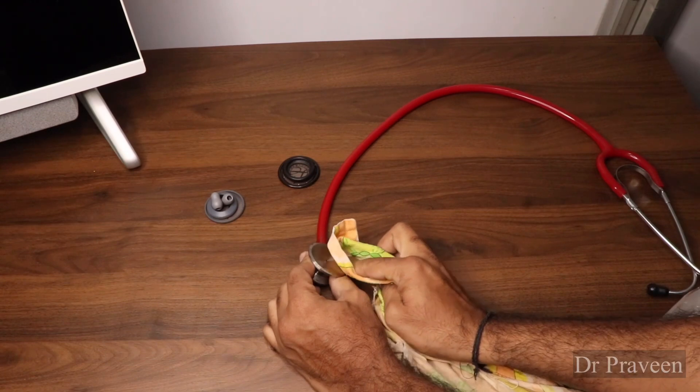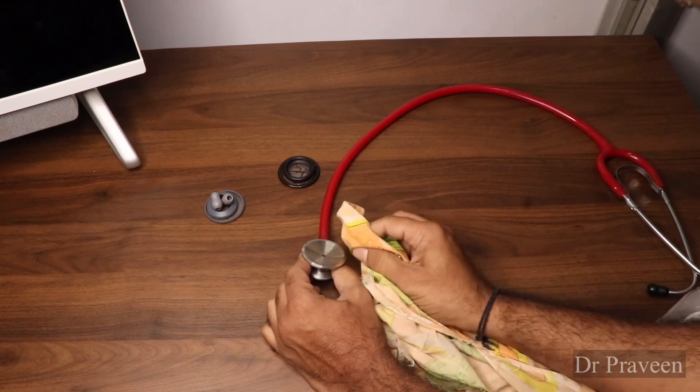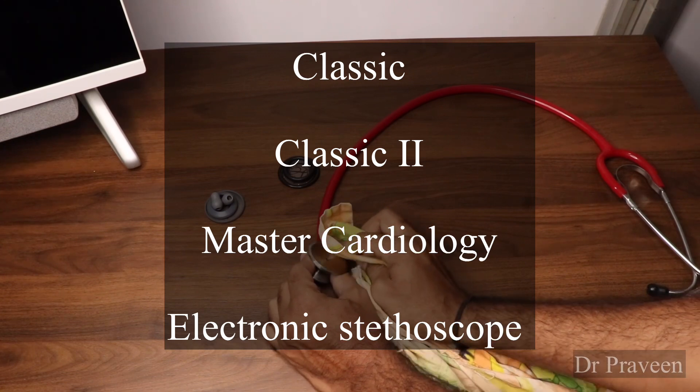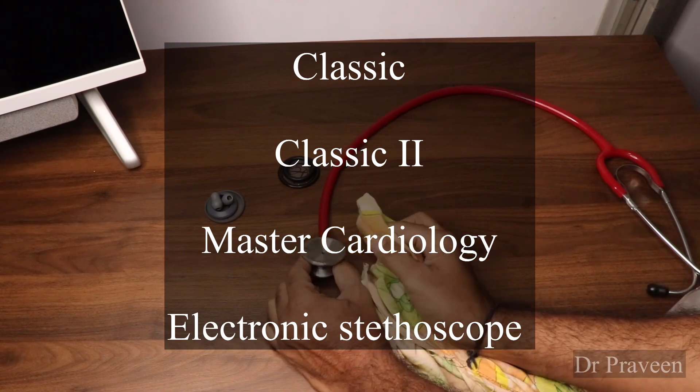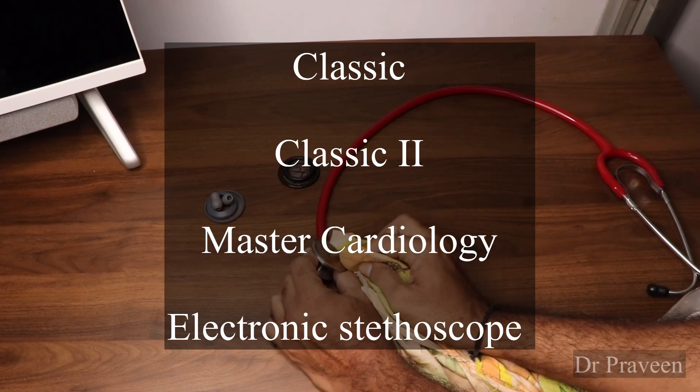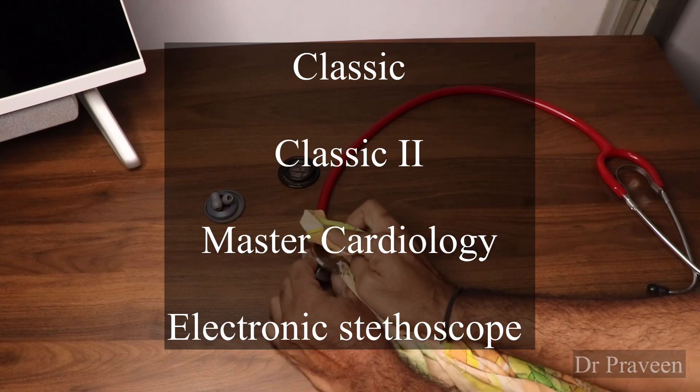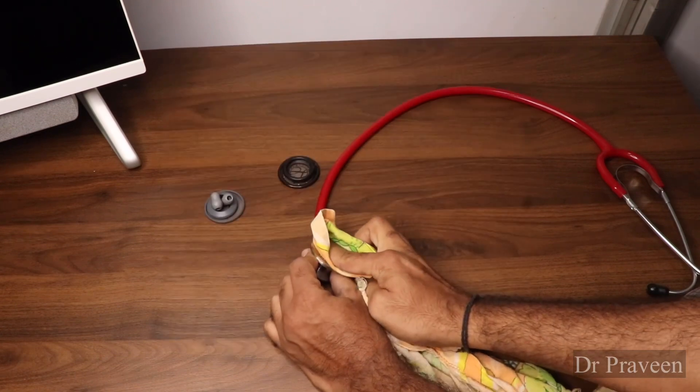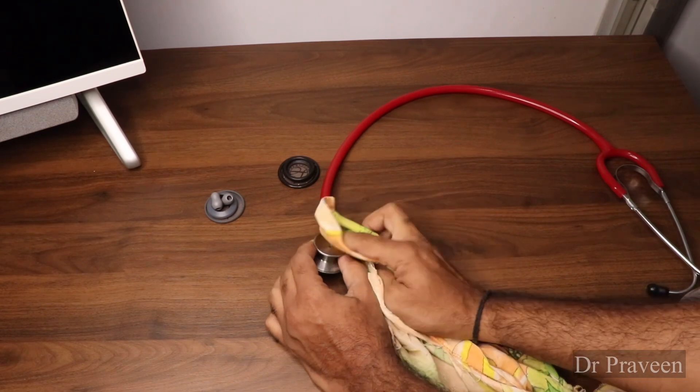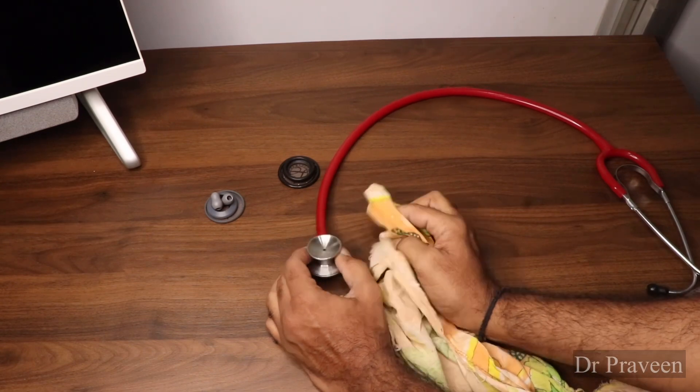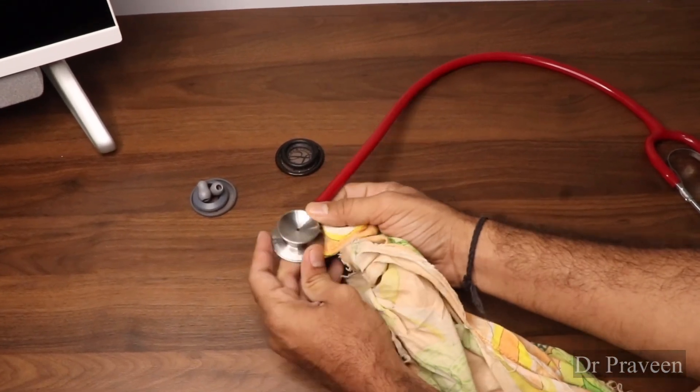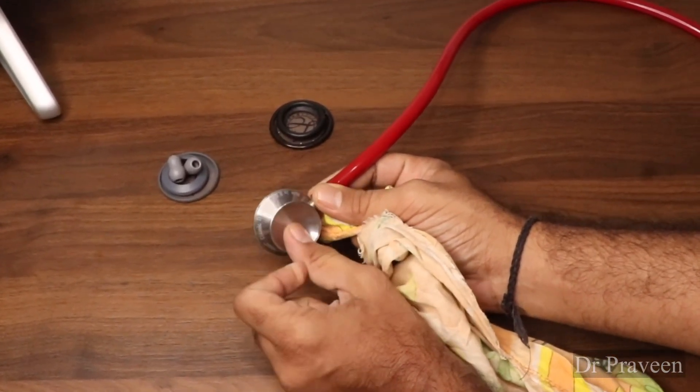There are different variants of Littmann scopes that come. Classic II SE is the most commonly used, and next to this version the cardiac version comes, which has the diaphragm on either side of the chest piece. This is the Classic II SE.